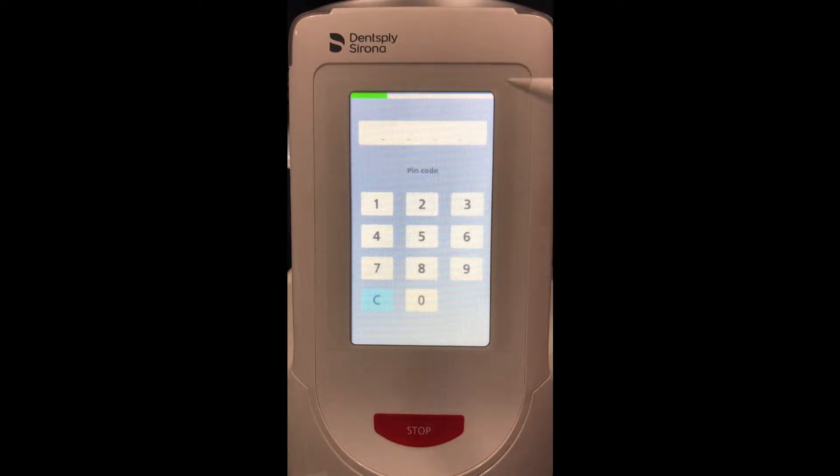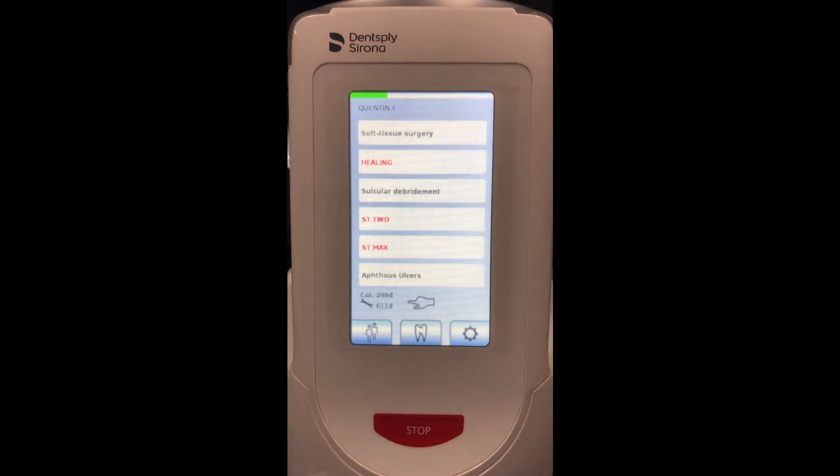Whenever we turn the laser on it's going to ask us to put a pin code in. There is a standard pin code for your laser that can be found in your user manual, and you can change that later. I'll put in my pin code, which is quad zeros, and it takes me to the home screen.